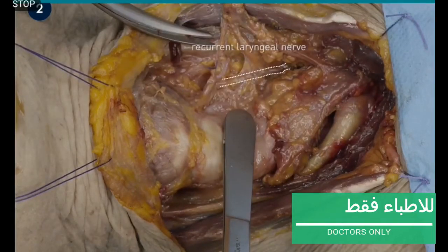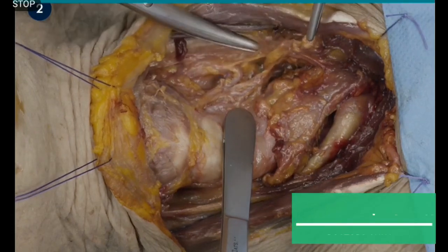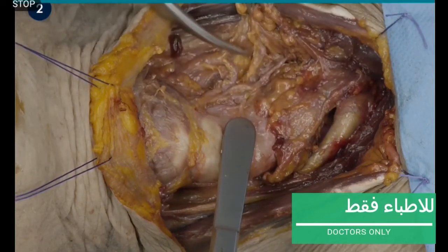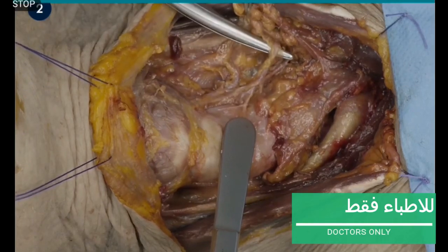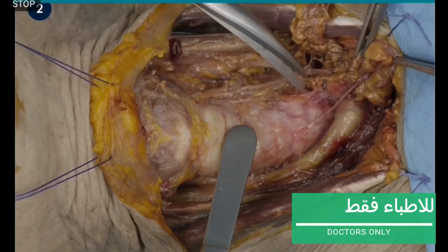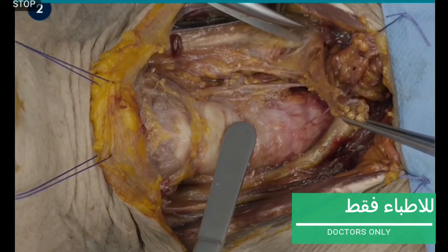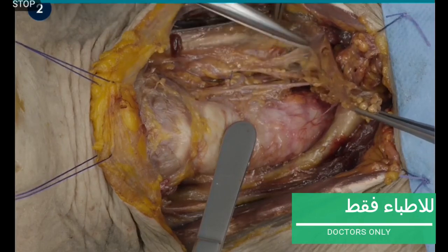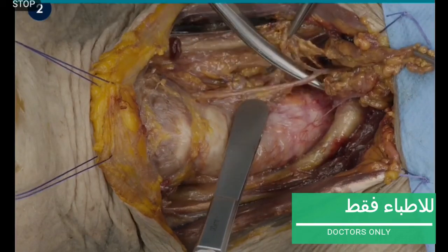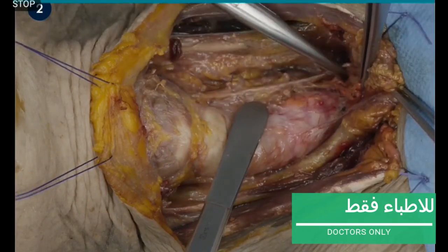The contralateral recurrent laryngeal nerve is now identified on the left side. Again, the lymphatic tissue is dissected off the carotid artery. The inferior thyroid artery runs deep to the carotid artery. The pretracheal dissection is completed on the left side. Then the dissection is continued along the carotid artery. The recurrent laryngeal nerve is continually visualized as it runs along the trachea and crosses the posterior side of the carotid artery.